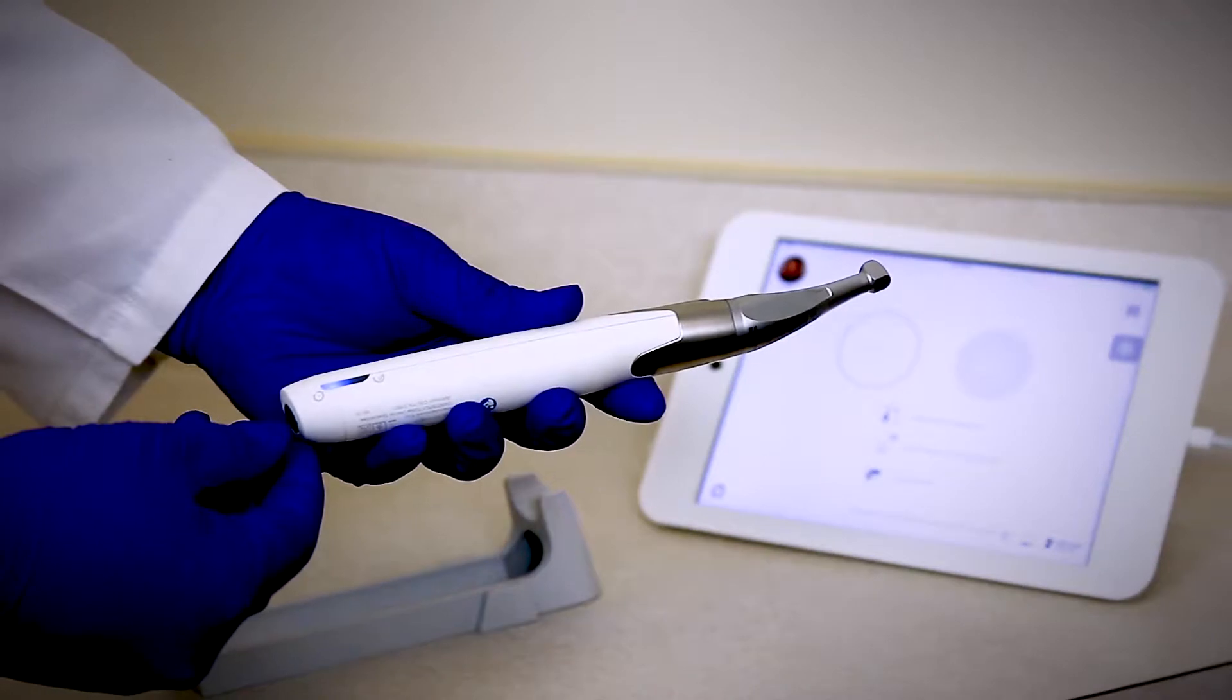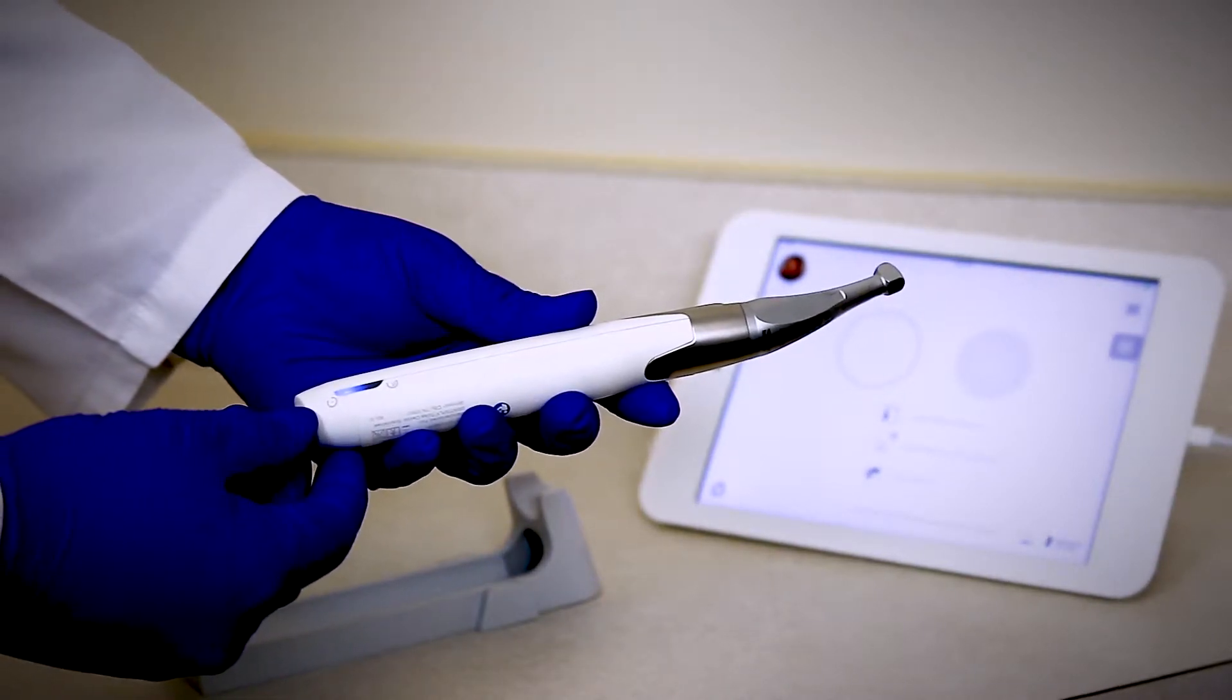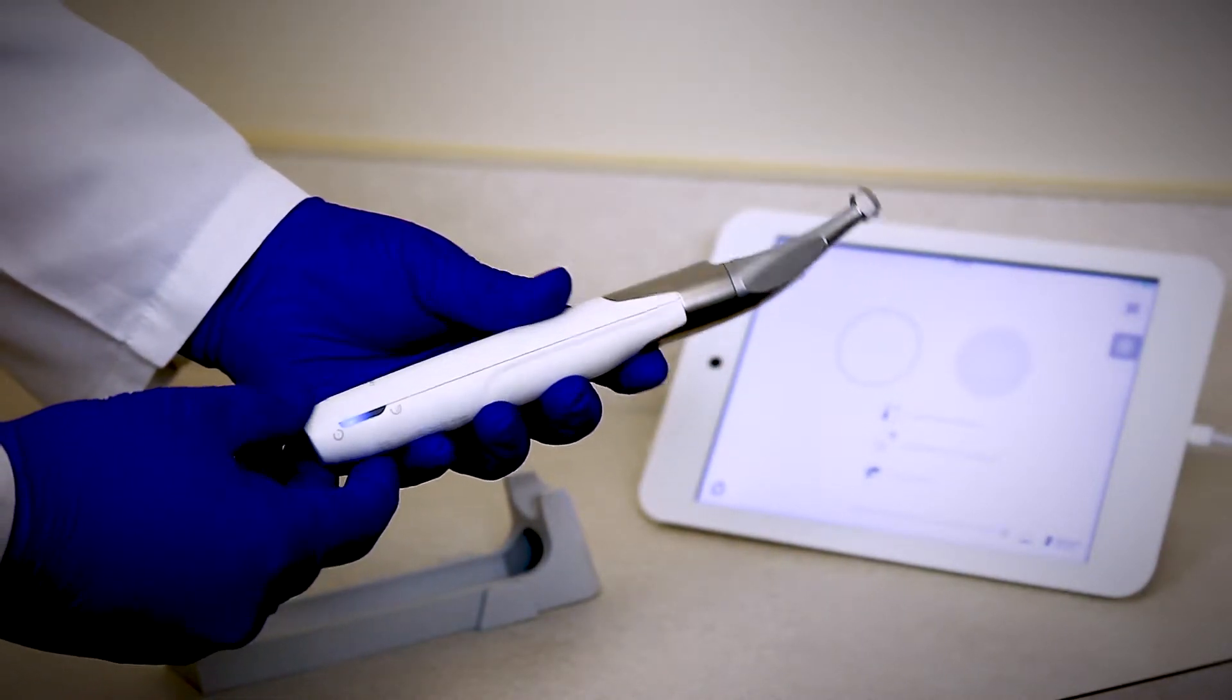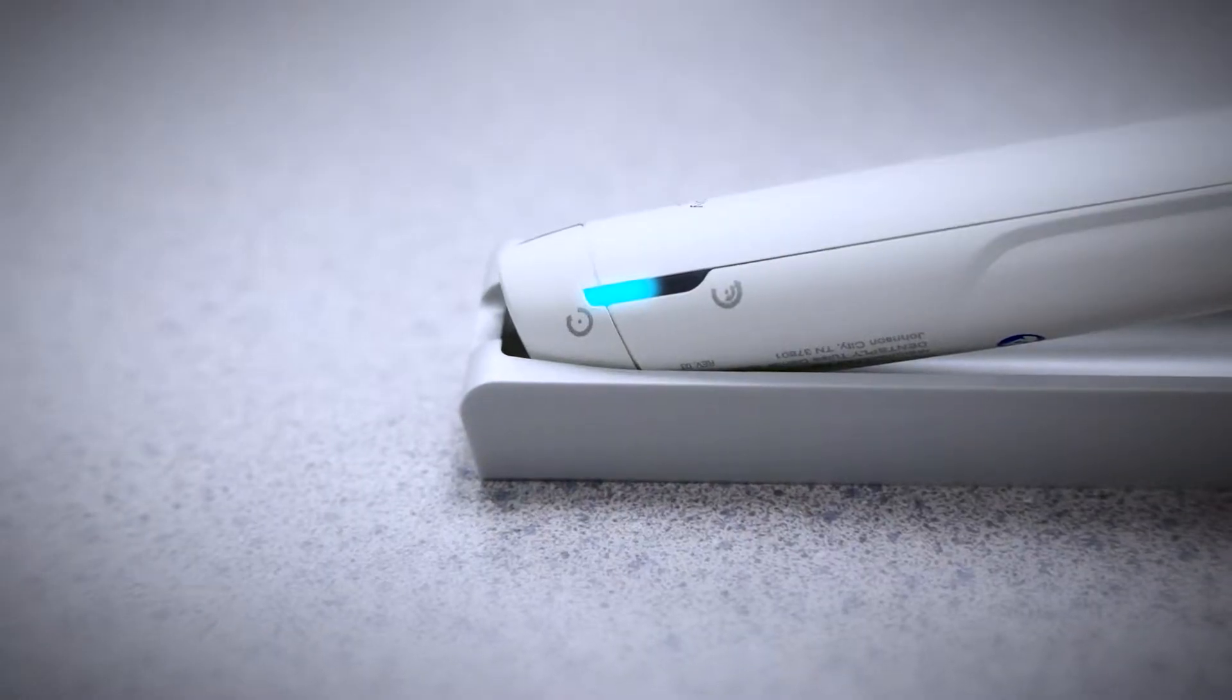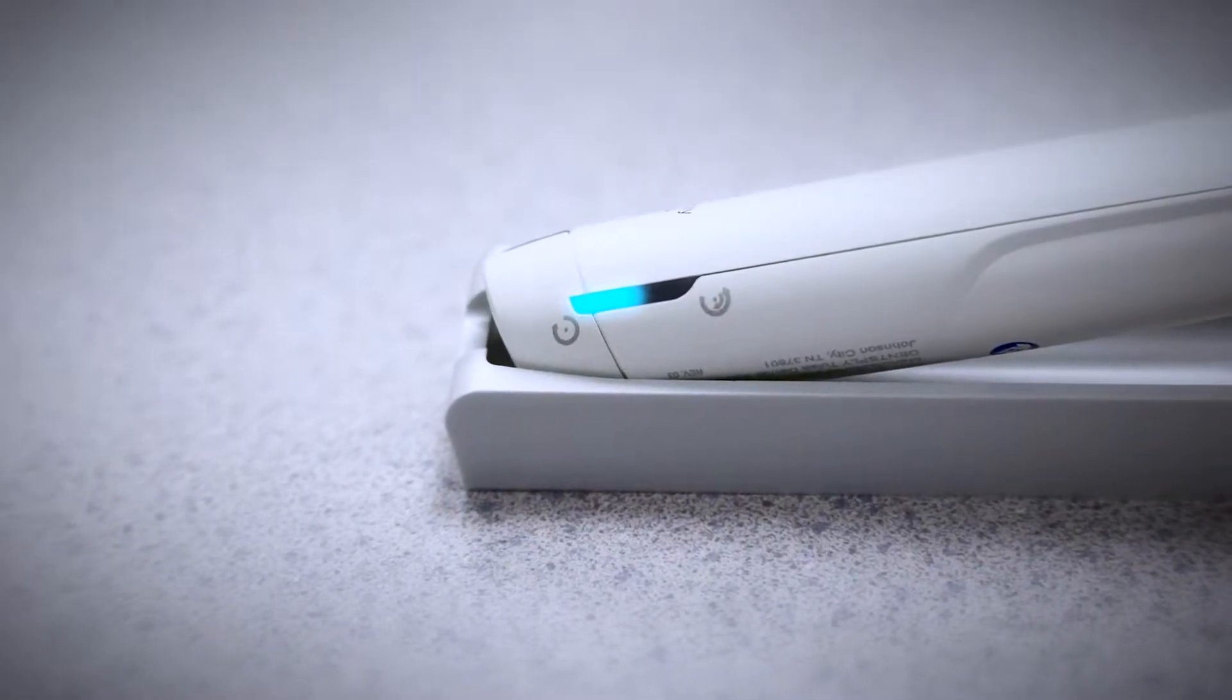On the other side you'll have the icon representing reciprocating motion and continuous motion. A blue light will appear next to what motion is being used.